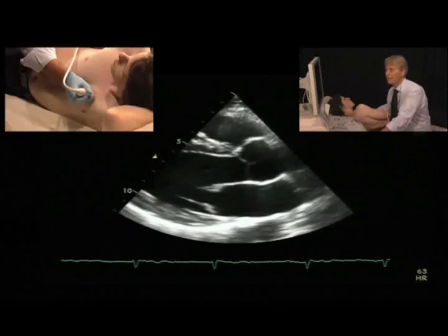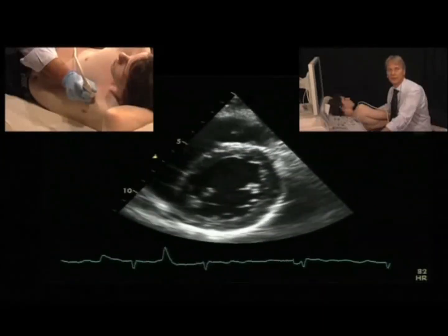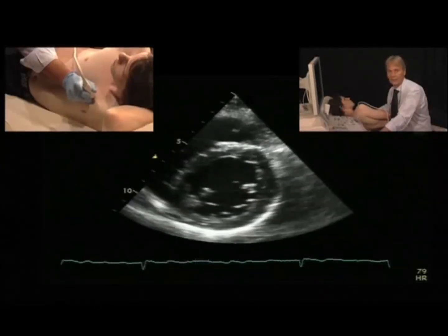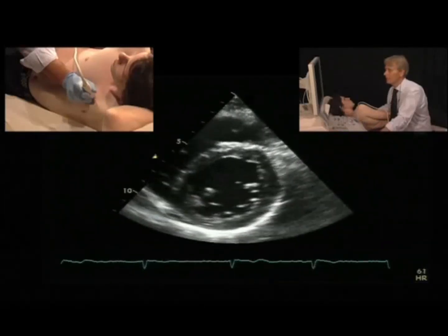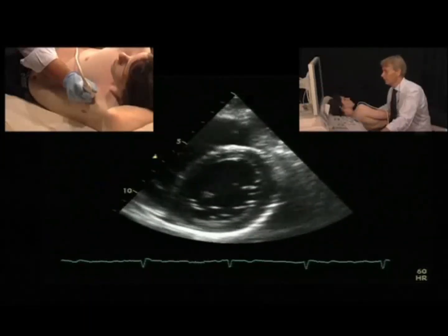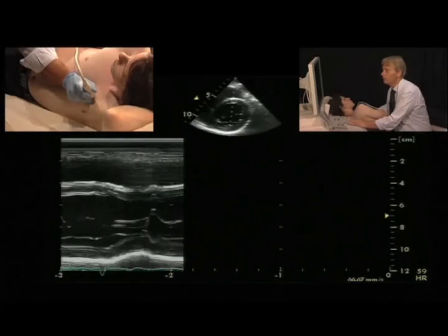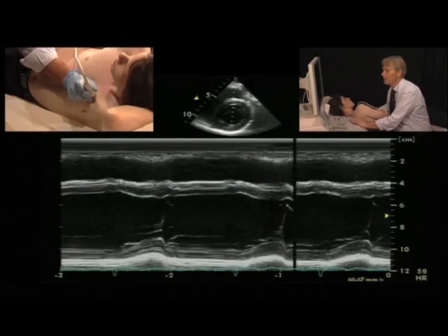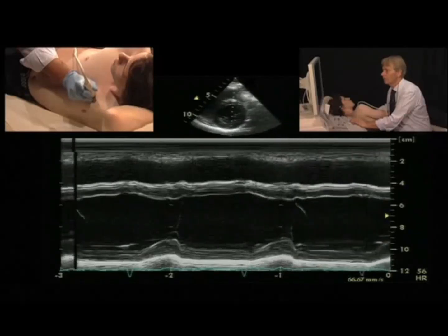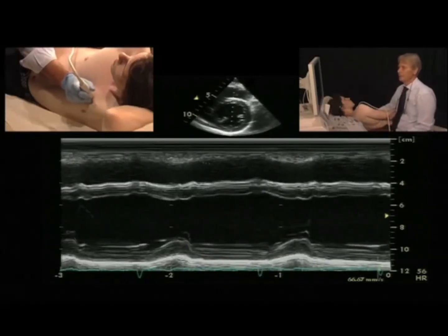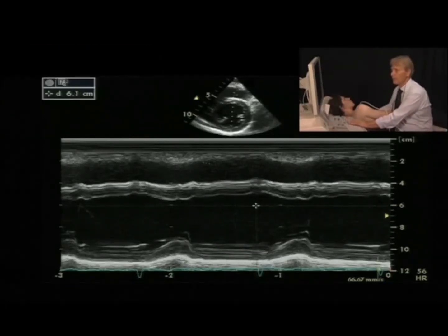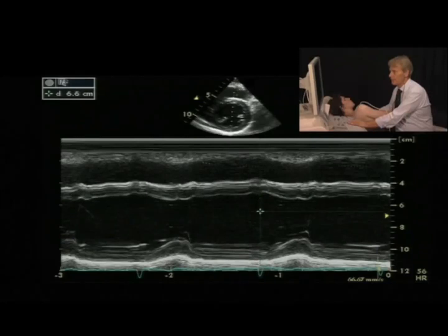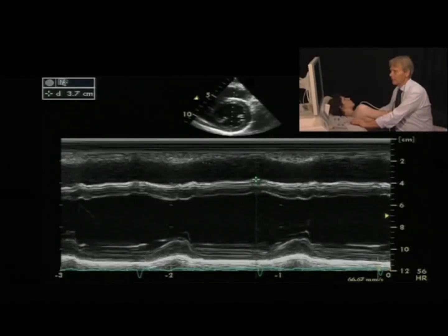To perform an M-mode measurement of the left ventricle, first check that the ventricle is really round. Once you have a nice view, place the M-mode exactly through the middle of the left ventricle. Optimize the image for a good contour, then freeze and measure the septum at diastole — at the largest width of the left ventricle, just before the QRS complex starts.